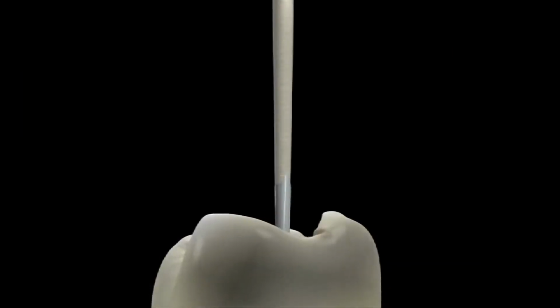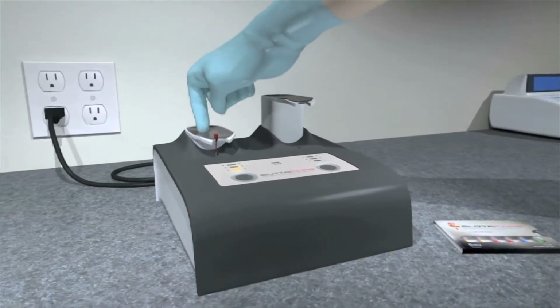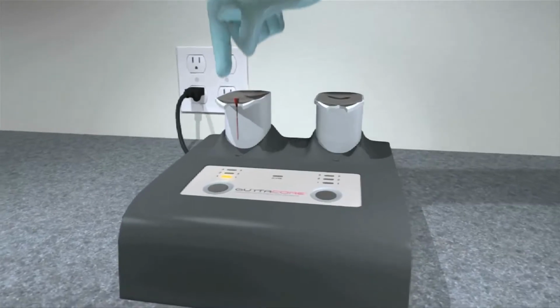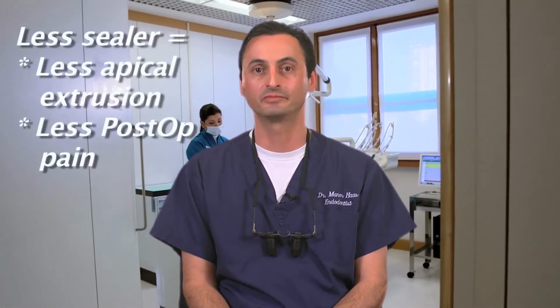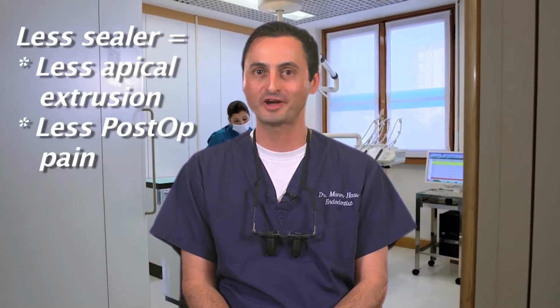Finally, I'd like to say that one of the many great aspects of this obturation system is that thanks to the small amount of sealer required, canals are almost entirely filled with warm gutta percha and with very little sealer, as you may see in this photo. That's undoubtedly the ideal kind of obturation and a great highlight of the GuttaCore obturation system. Also, keep in mind that less sealer means less apical extrusion and less post-op pain.